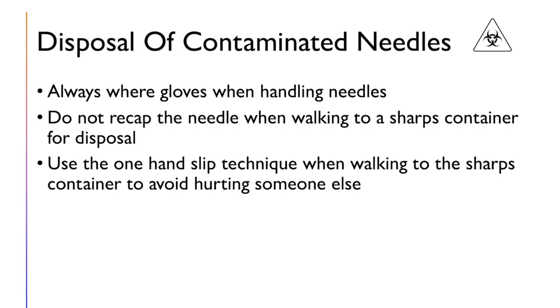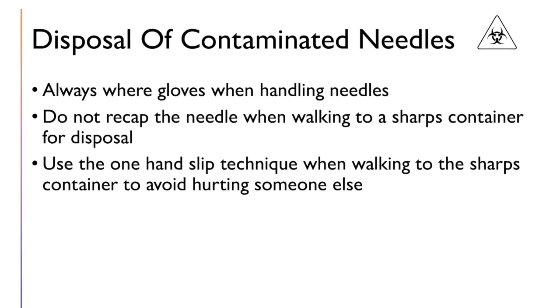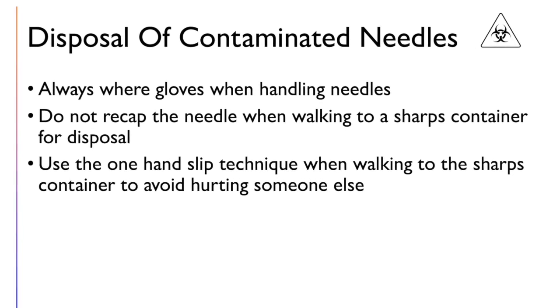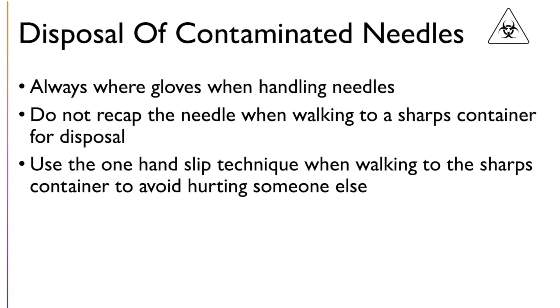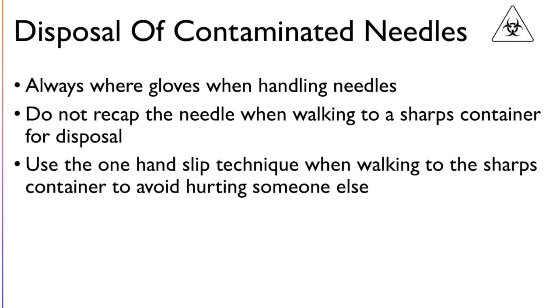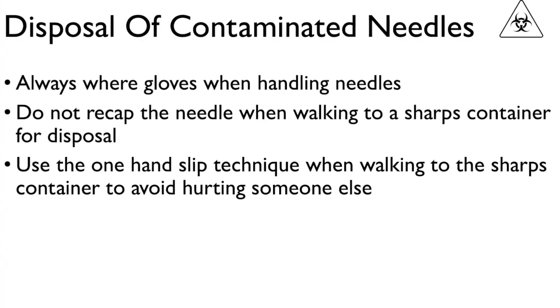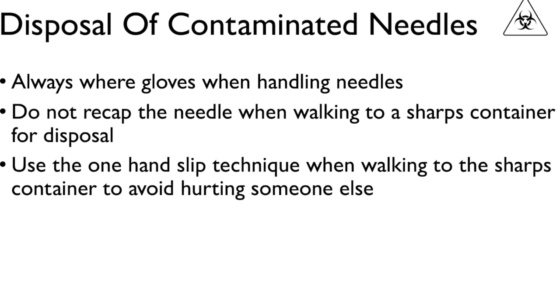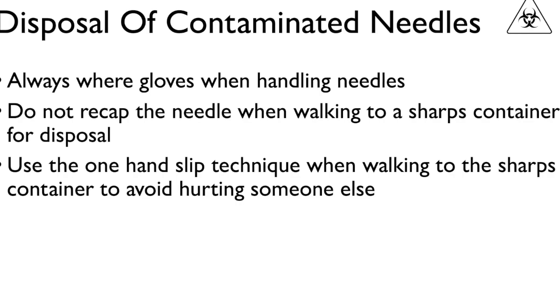Continuing on with the theme of needles, we're going to talk about disposal of contaminated needles. The first thing to really remember is never to recap the needle. So always wear gloves. Don't recap it when you're walking to the sharps container. And then it's also important to use the one hand technique so that you can prevent injury from any people who are walking in or out of the room.